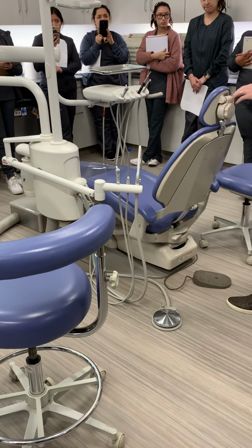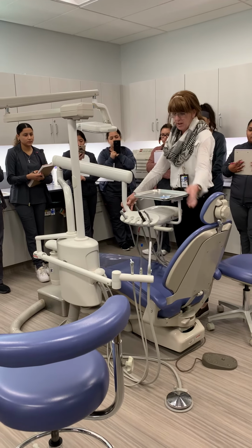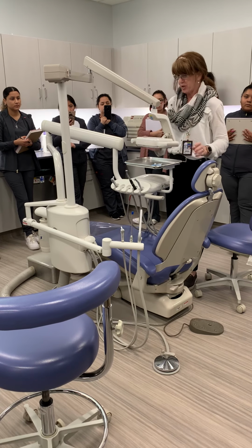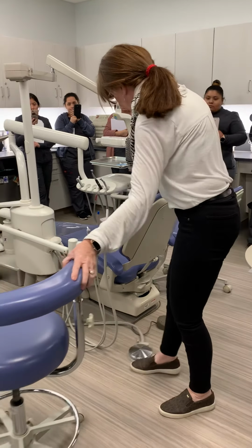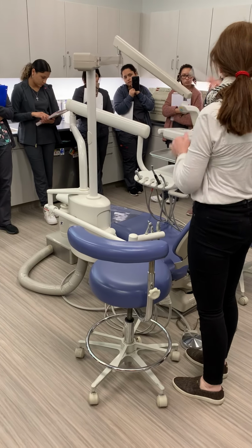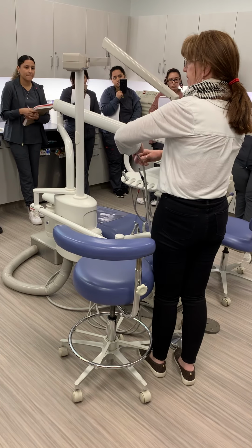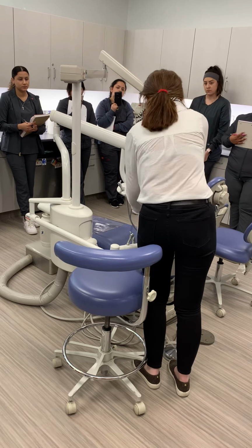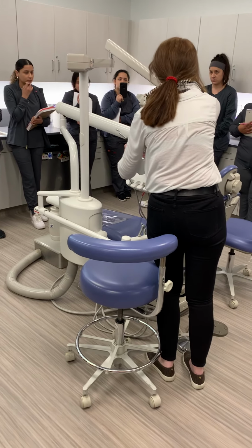Okay. And then when we are done, we put the unit to sleep. So we always tuck in handpieces away from the chair, light directly over the bracket tray table. Chairs tucked in so cleaning people can get in. And we never, ever, ever, and I'm sure she said that, leave any items attached, right? Because we don't know the next day if it's clean or dirty. Okay? So everything would come off and go back on the tray in which you're using it, or go to sterilization depending on if it was used.